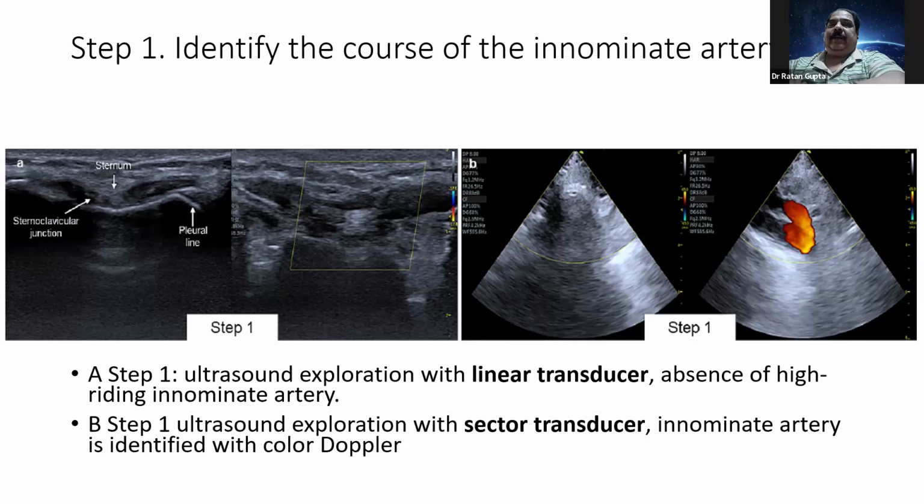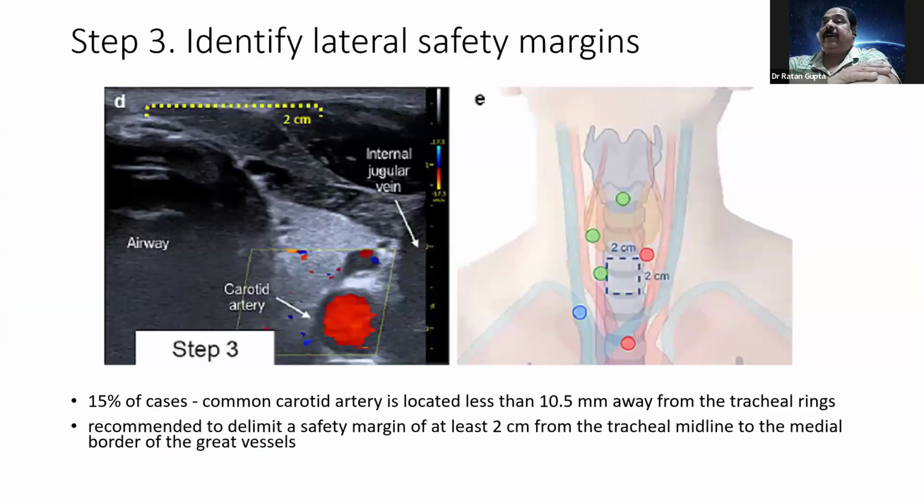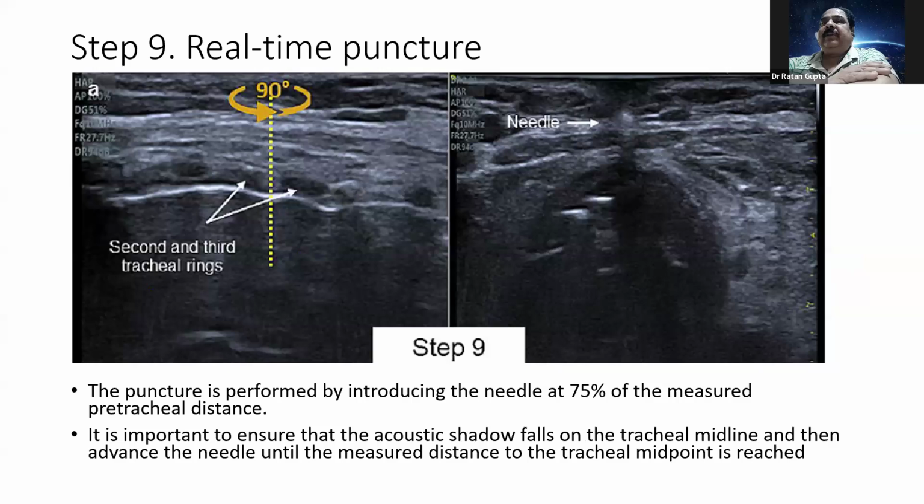Okay. I think quite a few people in my center also are trying to do it real time. Yes, I think I'll have to get better at doing that as well. But we are using ultrasound for all our tracheostomy patients. We definitely try to rule out major vessels, and sometimes we do have difficulty with the anatomical landmark technique. You go to the side. Once we use ultrasound, the first pass success definitely goes up.